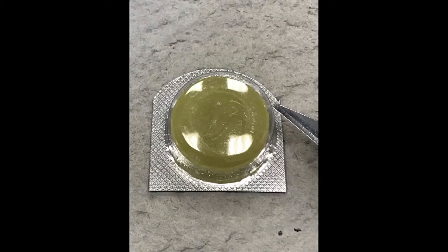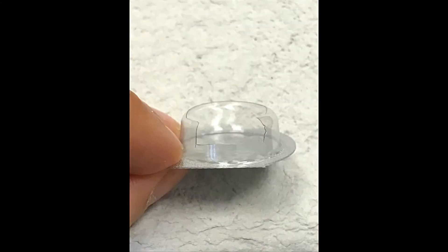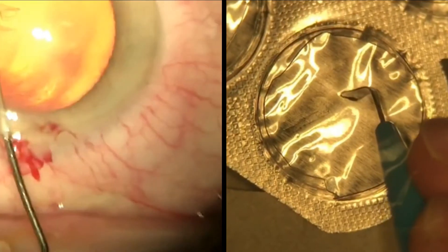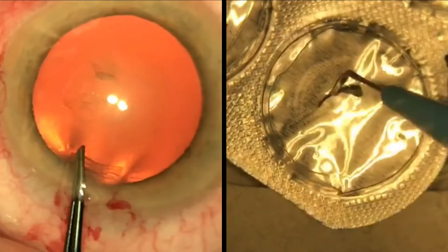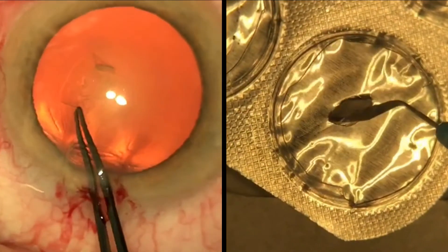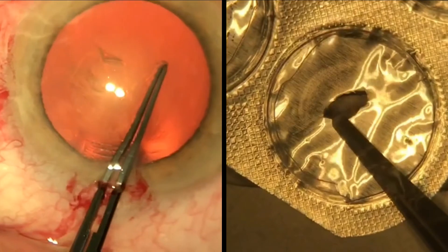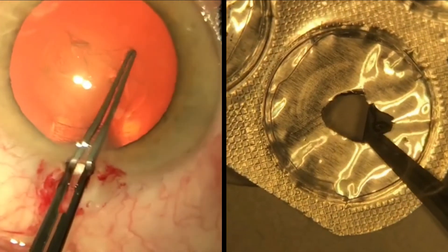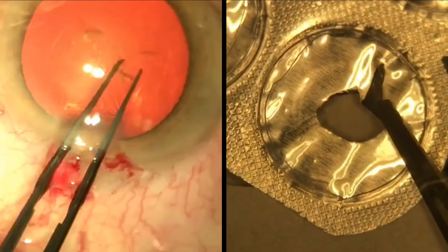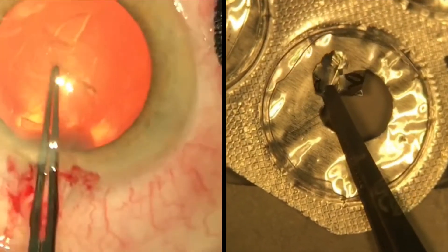The next step is capsulorexis. We have used a cough sweet lozenge packet and removed the plastic top with the blade and cut into the side to allow instrument entry. As the aluminium foil is more robust than a lens capsule, we have used a keratome to pierce the anterior capsule and extend the tear. We subsequently used Mohrfield's forceps to grasp and turn the flap in a continuous curvilinear fashion. The approach of the angle of the keratome and forceps is similar to what is performed within the globe.